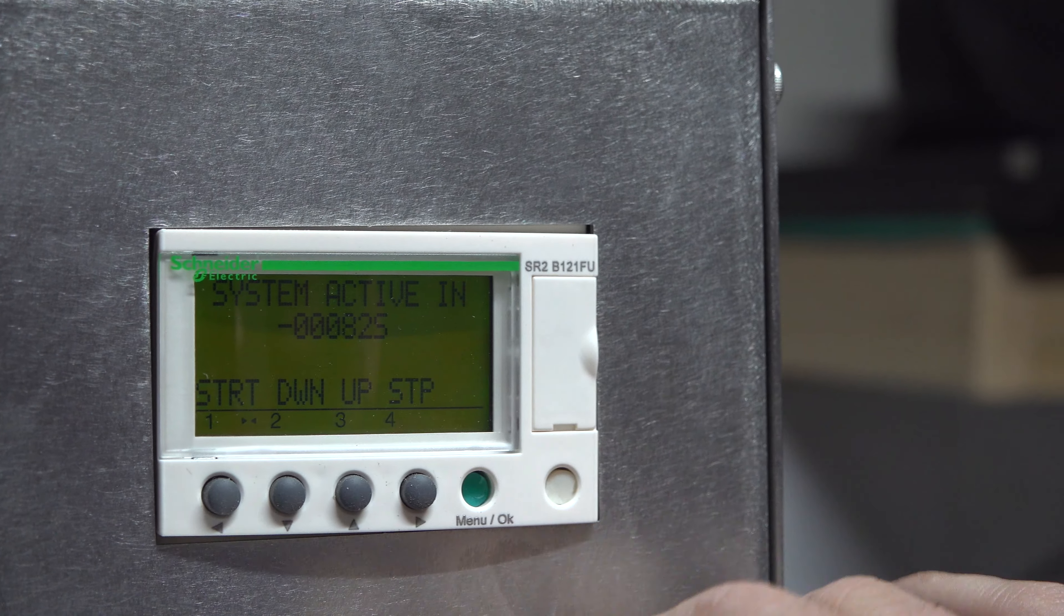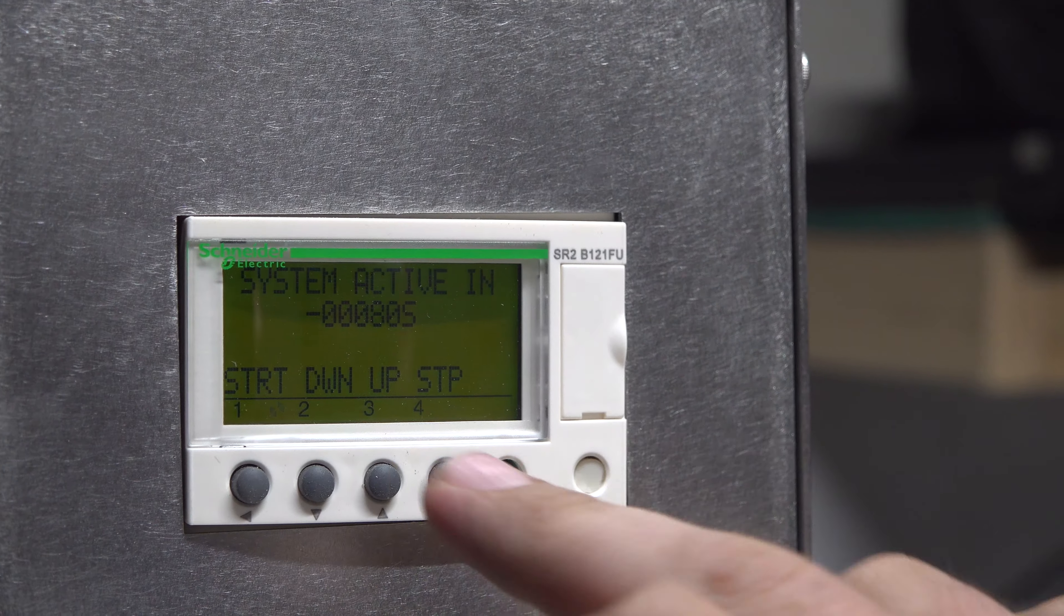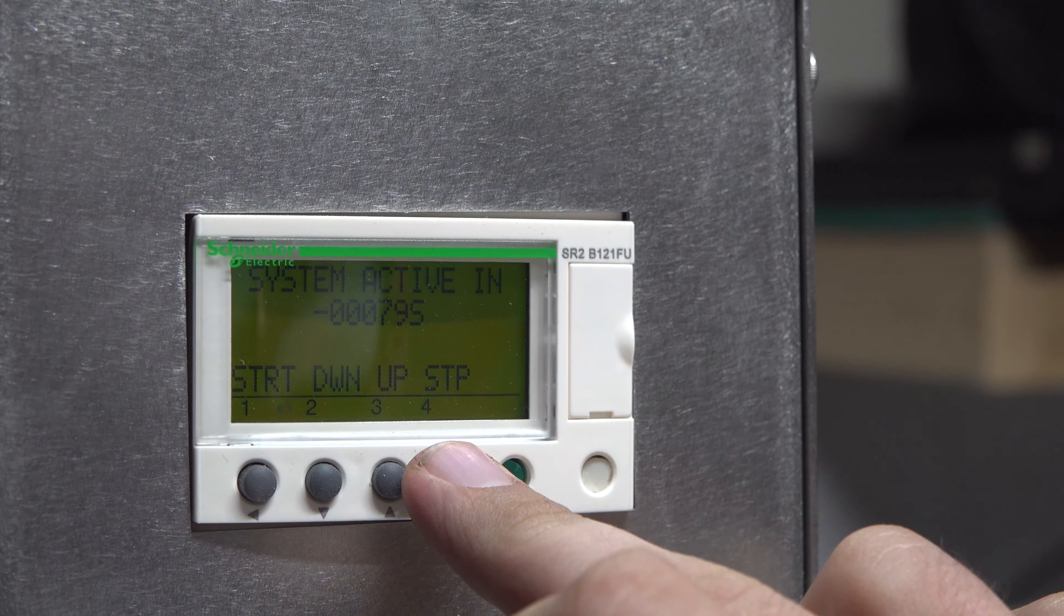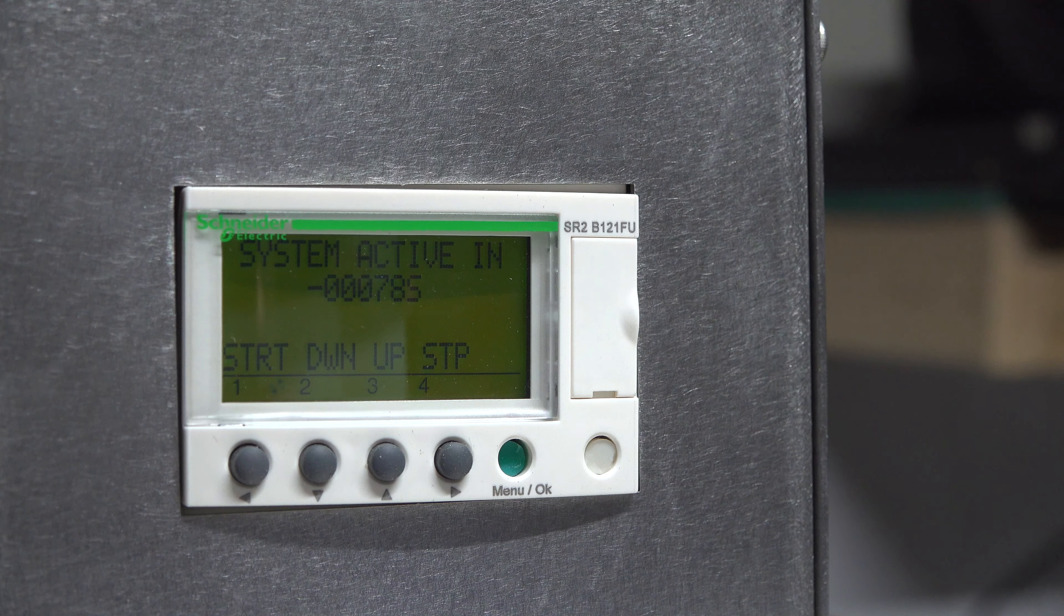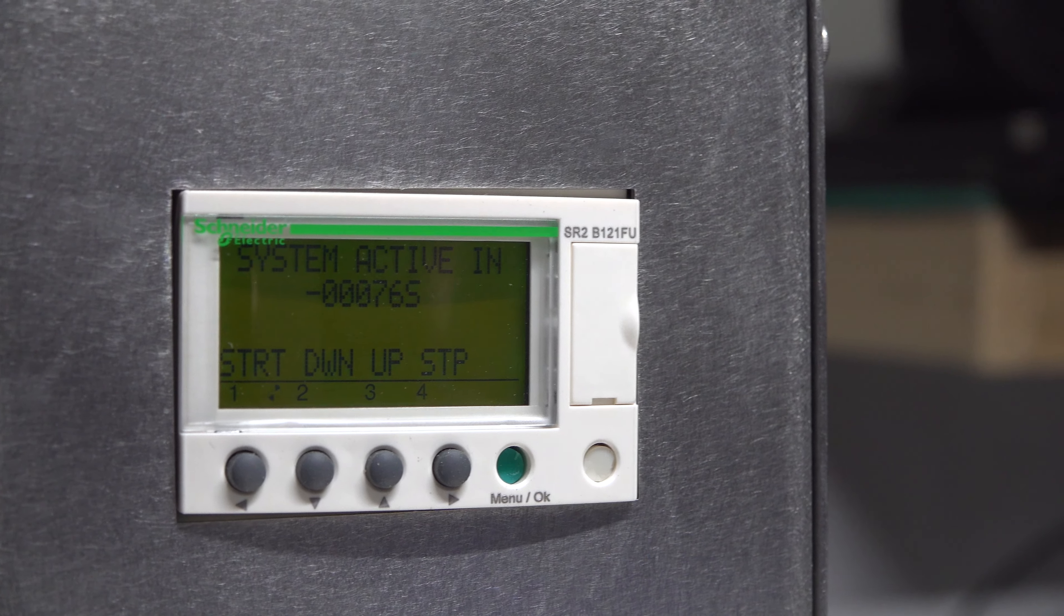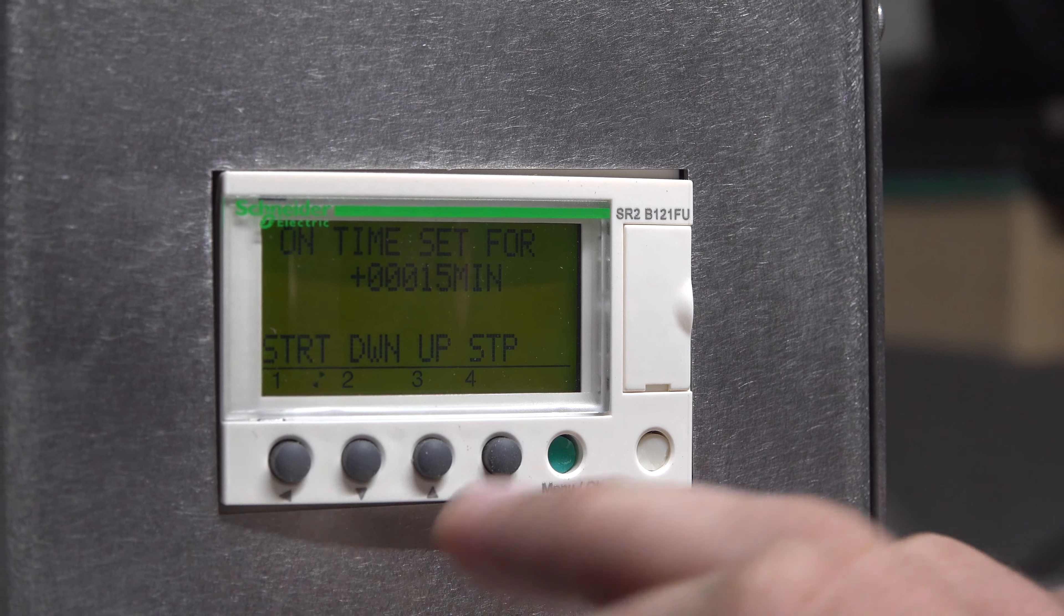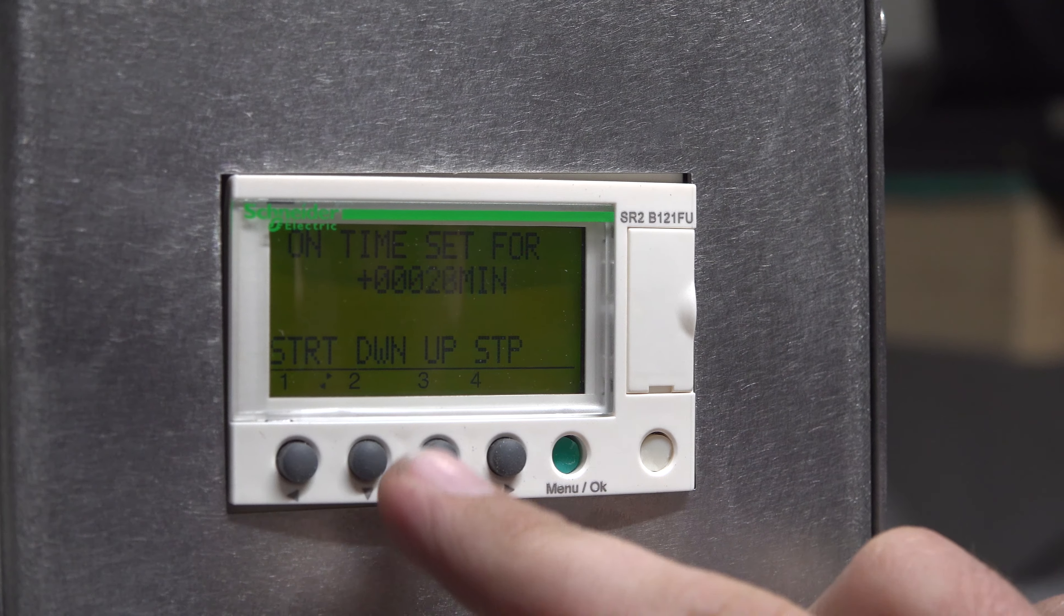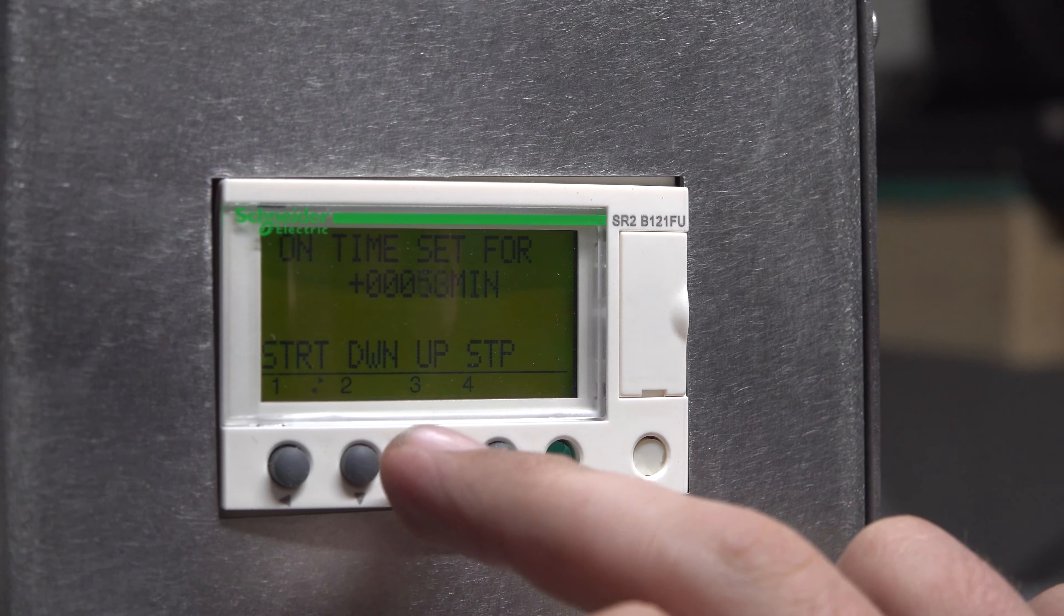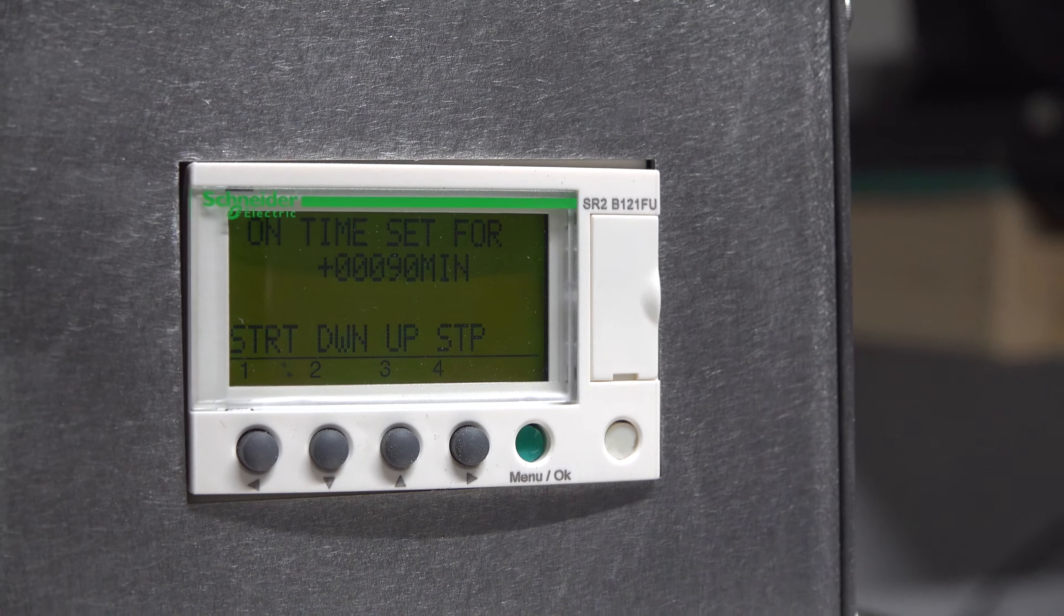You can stop that with the stop button, or the motion sensor can stop it, or you can unplug it. It also retains memory, so if you have it set at 90 minutes and we unplug it and plug it back in, it'll stay at that set value.